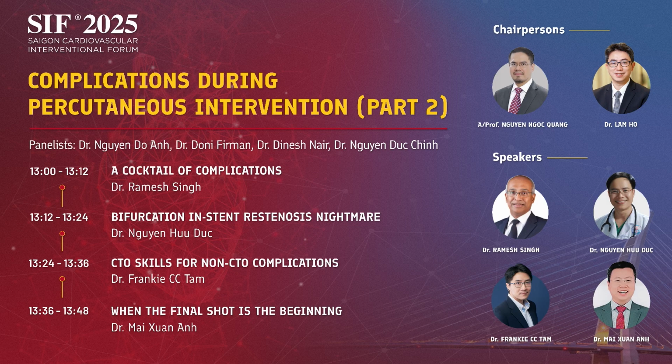Yeah, I'm Dr. Trịnh from Vietnam. Dr. Đức has a very good case and very good results, but I don't know what the size of the diagonal is when you push the stent and kissing balloon. Did you have an FFR for the diagonal before you put the stent? I know you did FFR and you decided to stent it.